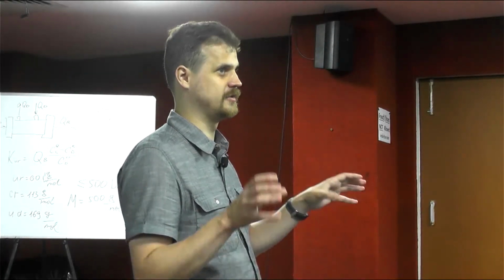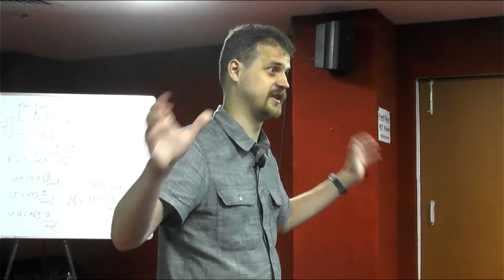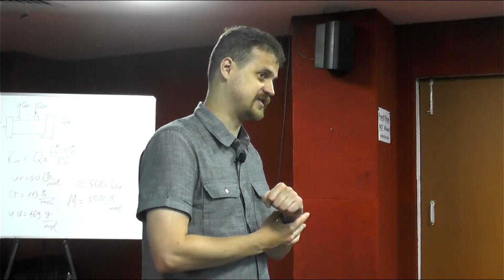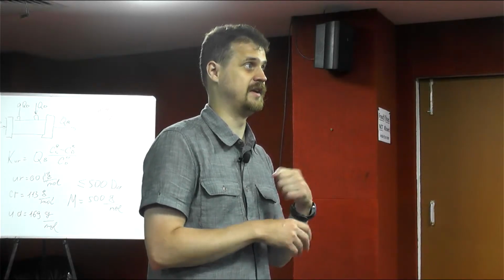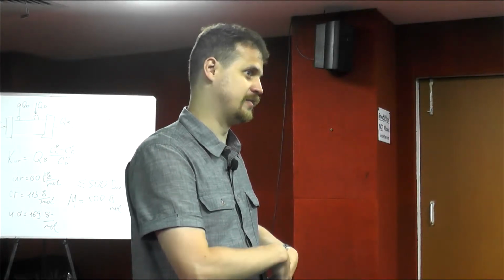So on its own, it's a very complicated topic, and I think some people can even formulate an entire lecture course just for wireless connection and wireless energy transfer. But you're correct. When we are talking about the wireless connection and wireless data link, we need to consider the safety issues, and we need to figure out if the wireless tools that we use in this feedback will not affect the temperature of the human tissues.